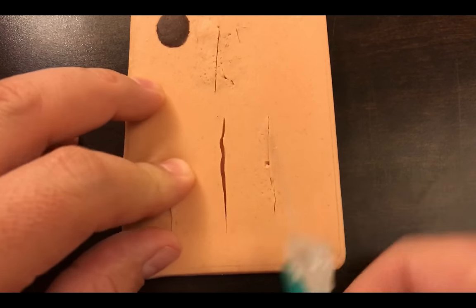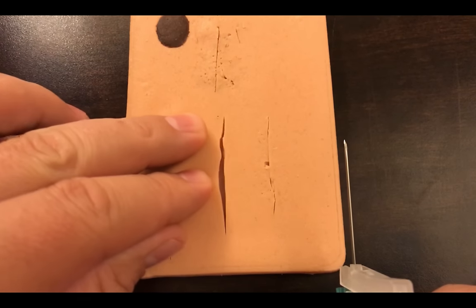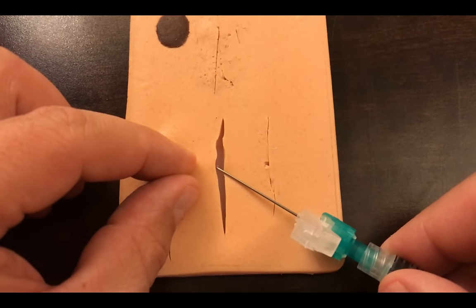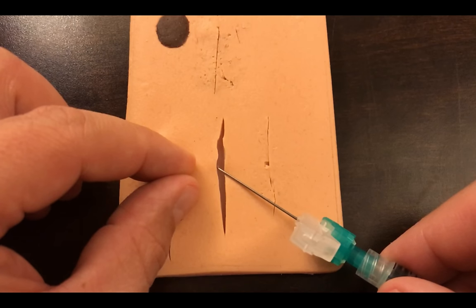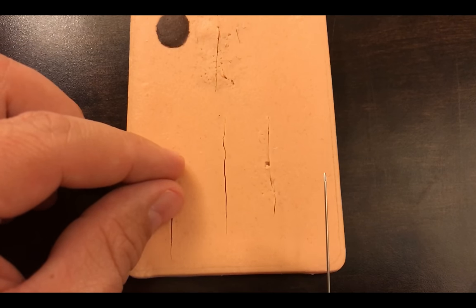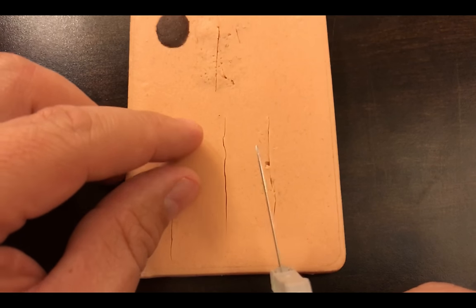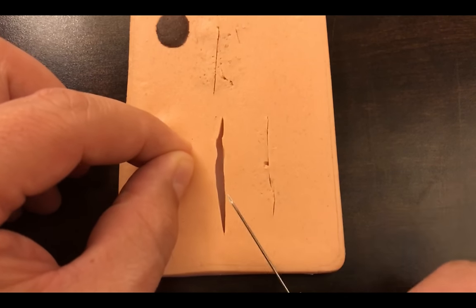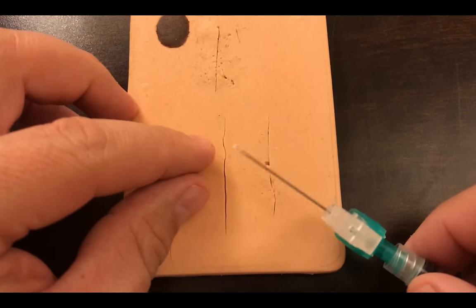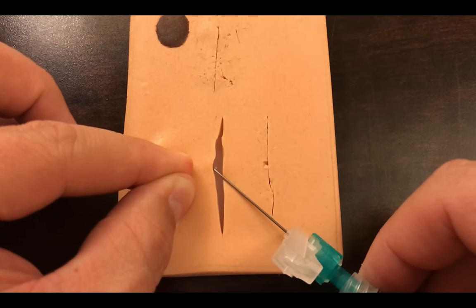For injecting lidocaine, notice we've got our skin edges pretty well approximated and it's a nice linear laceration. Whether I inject within the laceration itself or stay outside of it depends on one main factor: how clean was this? If this is an incision made in the operating room and we're adding local anesthetic before closure, because it's clean I'm going to use the skin that's already cut rather than penetrating additional skin.